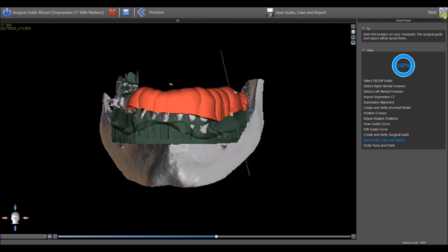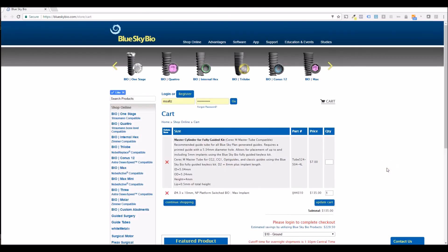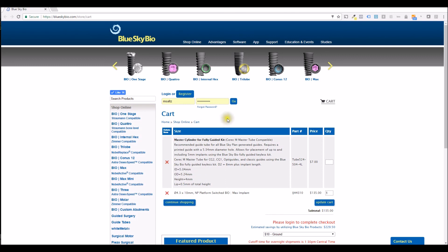Press the next button. The BlueSkyBio website will open automatically with the relevant metal cylinder and other relevant BlueSkyBio parts added to the shopping cart. If you already own the relevant parts or do not want to order it, press the red X to remove the parts from the shopping cart. Log in or register if need be and complete the checkout process.